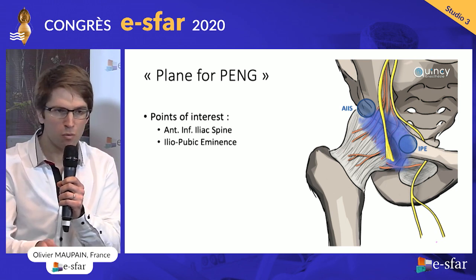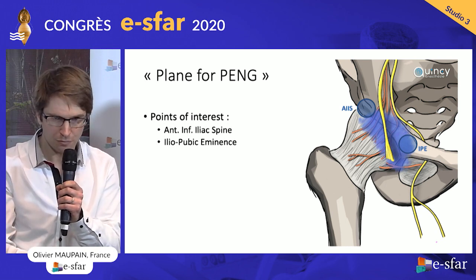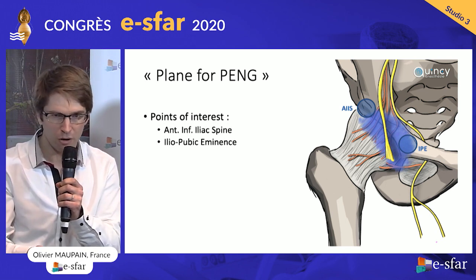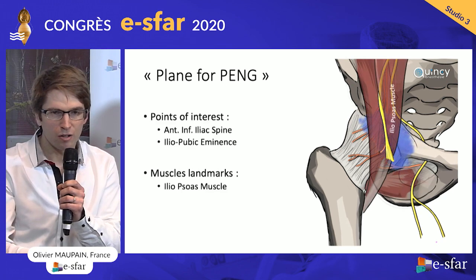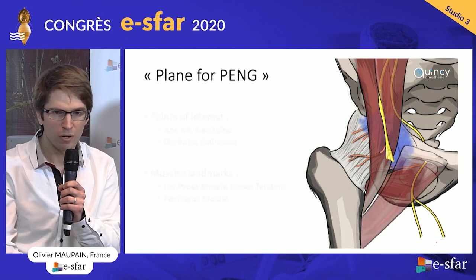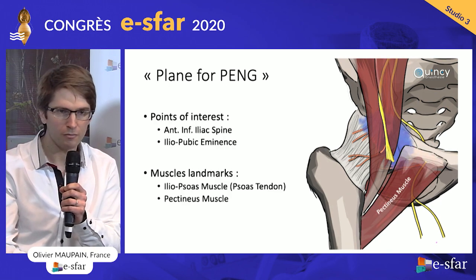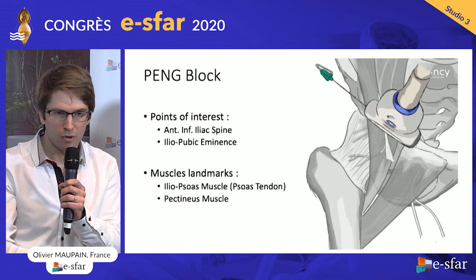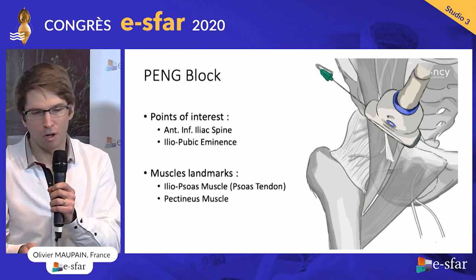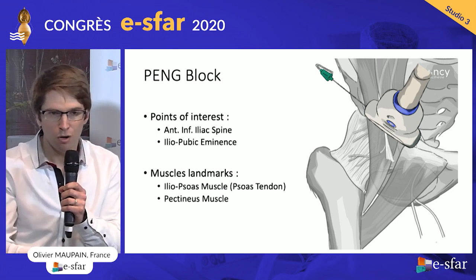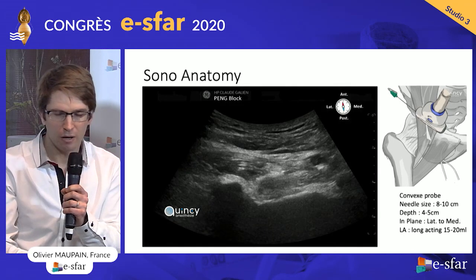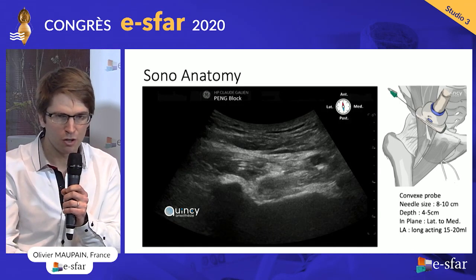And this is what the PENG block does. As I said before, it is a plane block, so you need an anterior barrier — and we have it with the iliopsoas muscle and with the pectineus muscle. Now we have to put our probe in the right place and insert the needle without damaging other structures. When you put your probe at the right place, you will have this image.